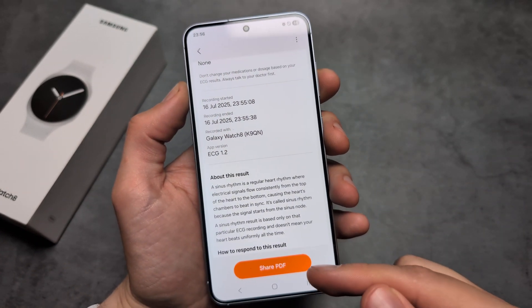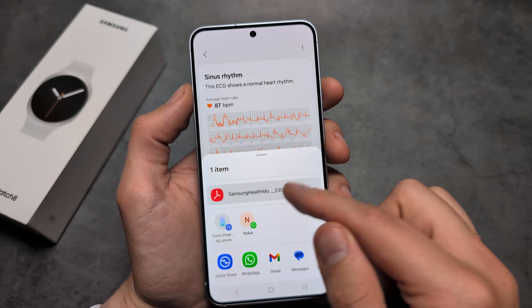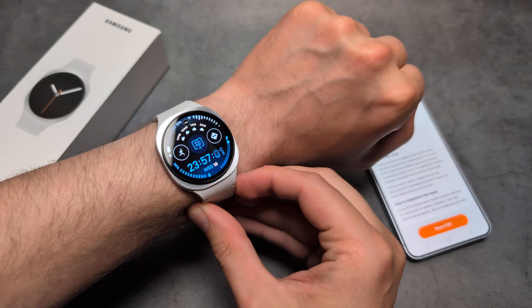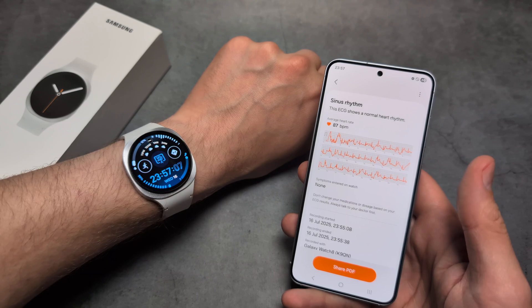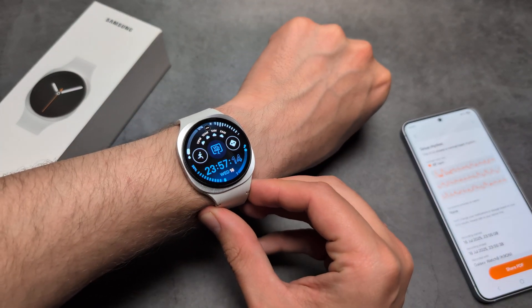You can even see the reading and share it with someone — maybe your doctor. It kind of sucks that this feature is only available if you have a Samsung phone. Maybe they have some legal stuff that prevents them from offering it to everyone else. So if you do not have a Samsung phone, you unfortunately won't be able to use this feature.